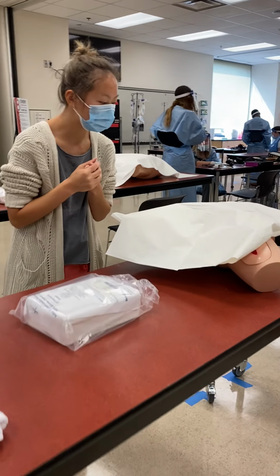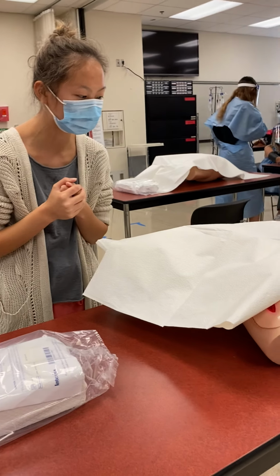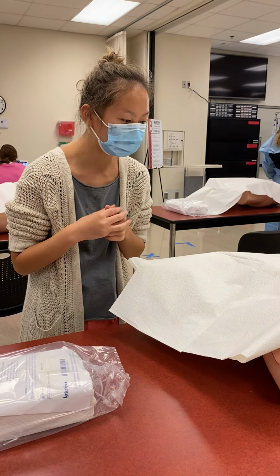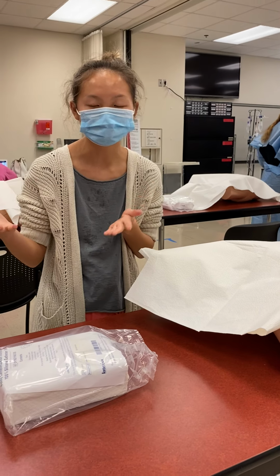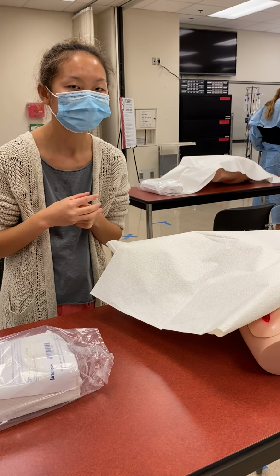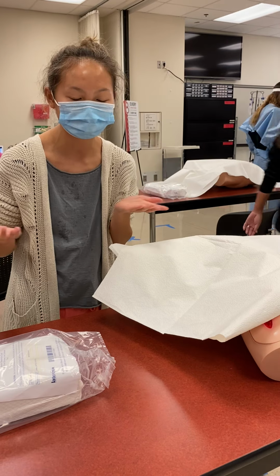Hello, my name is Sophia. Can you first give me your first and last name and date of birth, please? Okay, so today I'm going to be performing a Foley catheterization on you, and it was in the doctor's orders, which I checked with the MAR to make sure it was correct for you. You're getting it because you're going to be going to a procedure today, so they want to make sure that if you need to void and you're under anesthesia, you're able to do that perfectly.